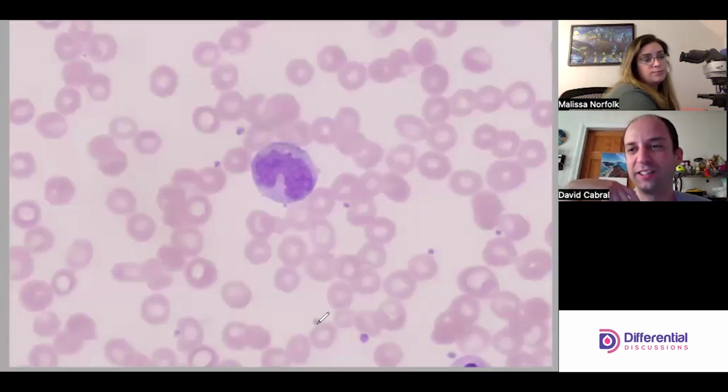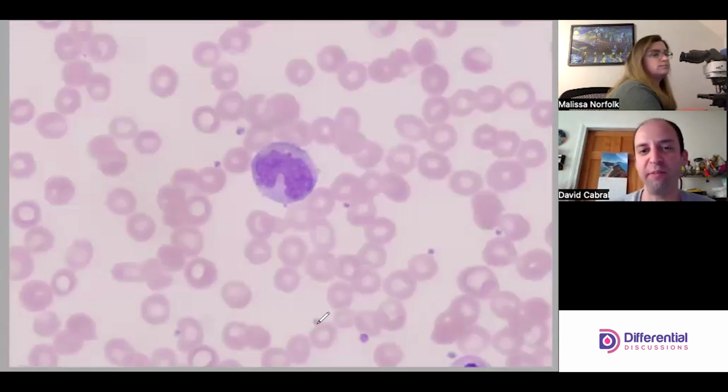I think he's just a mono. Yep. And so immediately the gerbil on the wheel for us is like, are there nucleoli, right? You're looking for that. But this is the horseshoe mono, this characteristic. Mhm. Absolutely.